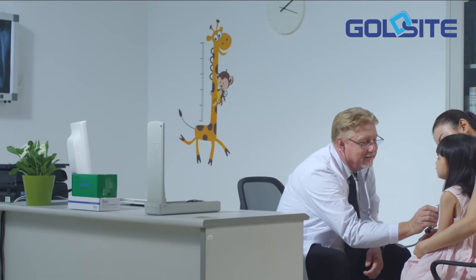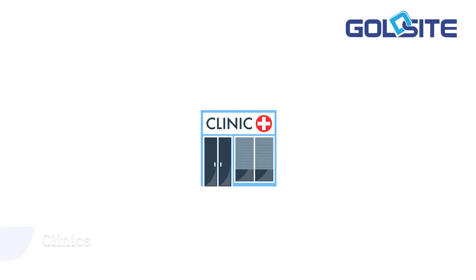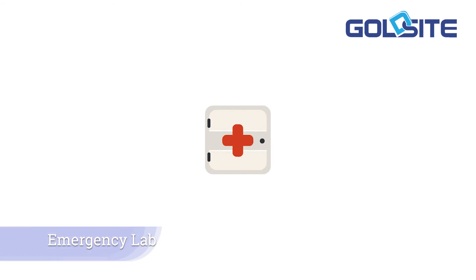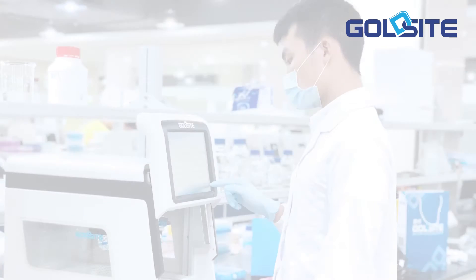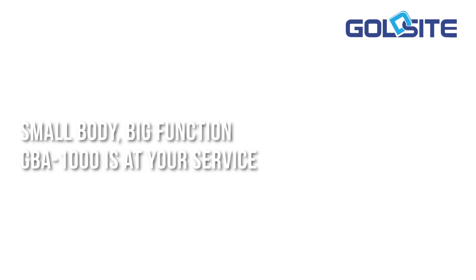GBA-1000 is ideal for small or medium-sized healthcare organizations, like small and medium lab clinics and emergency labs. Small body, big function — GBA-1000 is at your service. Lab quality within your reach.